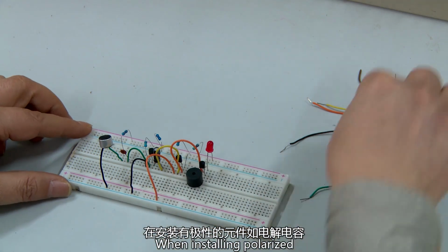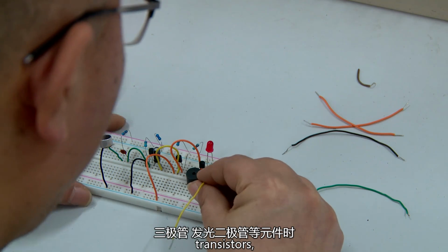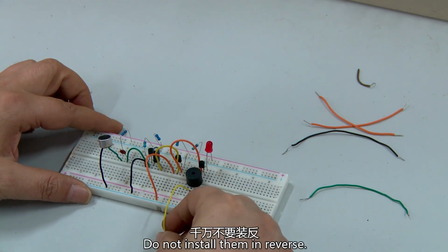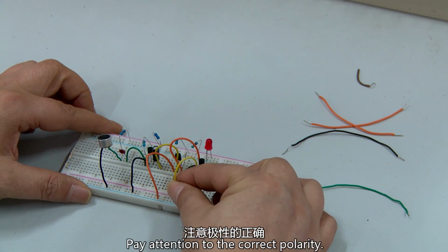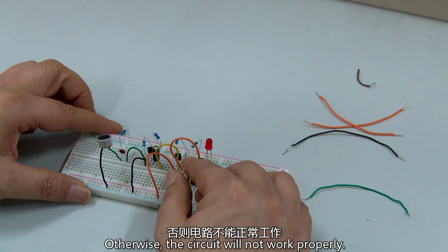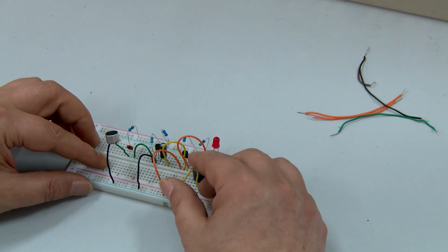Note: when installing polarized components such as electrolytic capacitors, transistors, light-emitting diodes, and other components, do not install them in reverse. Pay attention to the correct polarity. Otherwise, the circuit will not work properly. It may even burn out the components.